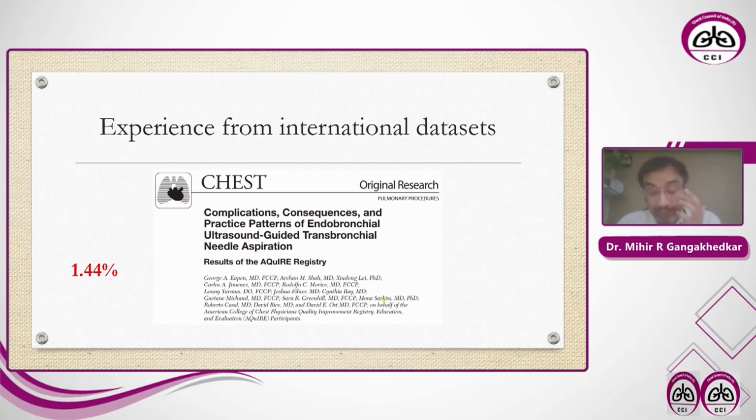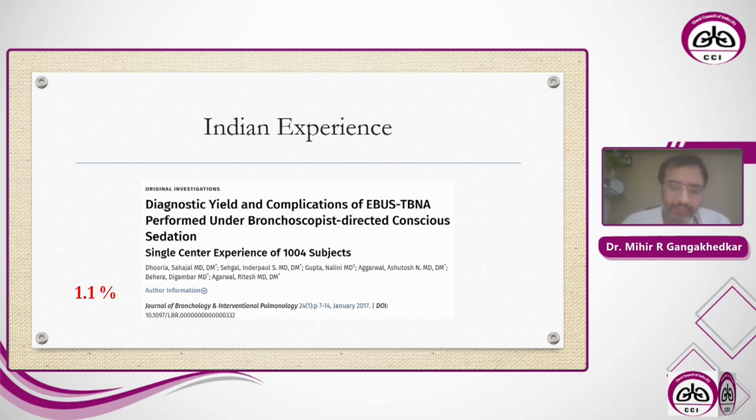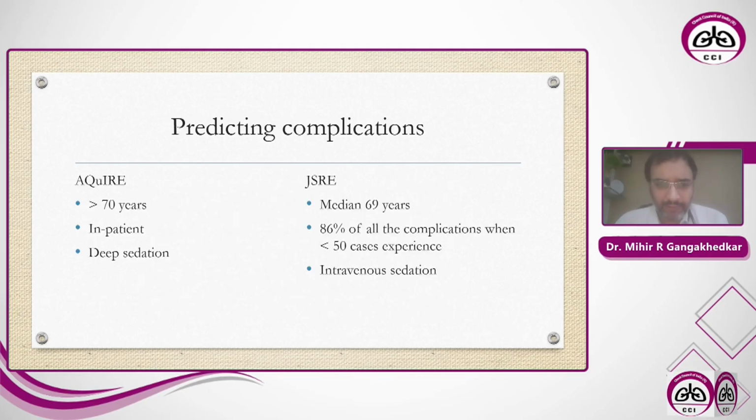And that was a retrospective study. In a prospective study around the same time, from CHEST, we had 1.44, and even our Indian experience from Sejal sir's team showed a 1.1% risk. So we're looking at a procedure which is relatively safe, with low chances of complications.